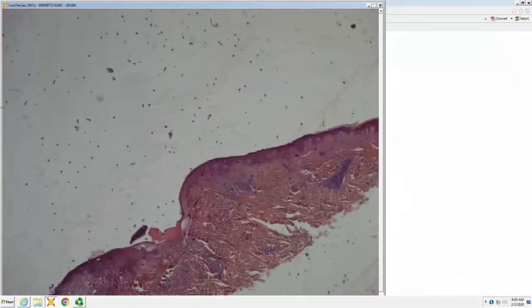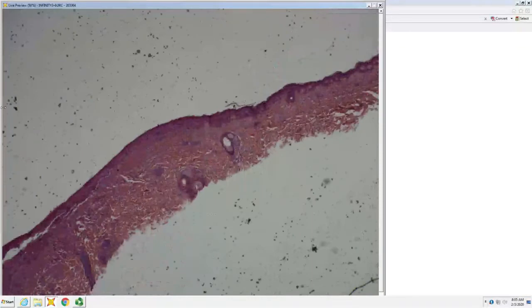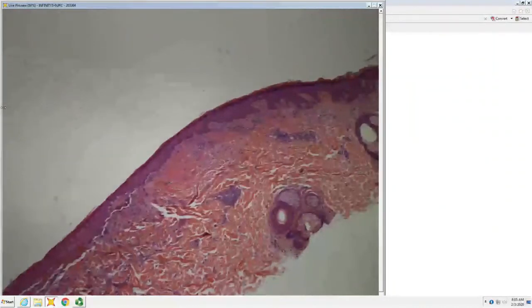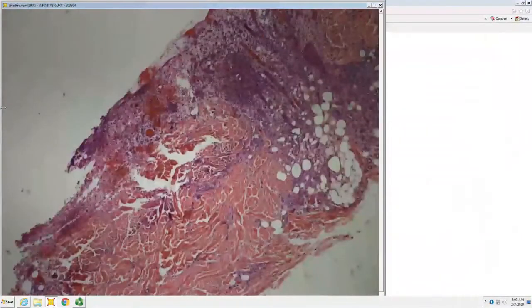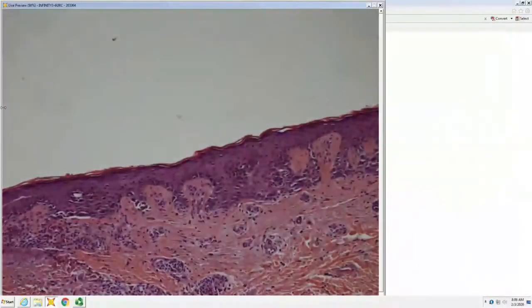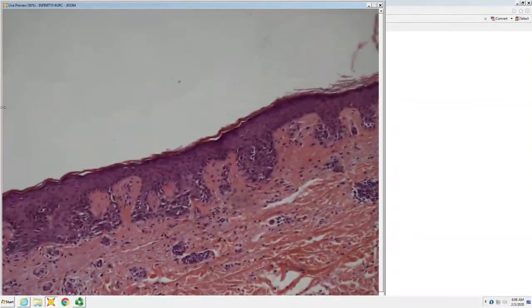Okay. 10 minutes remaining, so we ought to be able to do 100 slides. First off, you have some ulceration here, right? And then what else do you have? Is it an artifact or a blister forming? So neutrophils, crust, that may actually be where there's been a prior shave biopsy. And then what's at the periphery here? It's like collagen, it's like pushing into the... Well, so you have red ropey collagen.